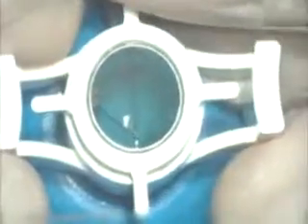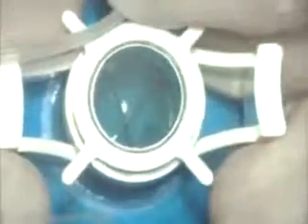The same Hessburg-Barron suction trephine of the same size is used with the exact same number of turns to provide a lamella of similar size and thickness. The lamella is then subsequently dissected and cut using a similar technique as for the recipient tissue. It is very important to maintain adequate pressure in the chamber, which influences the depth of dissection. The recipient bed is kept dry using a Weck-Cel sponge.